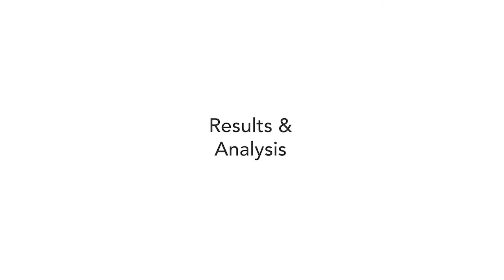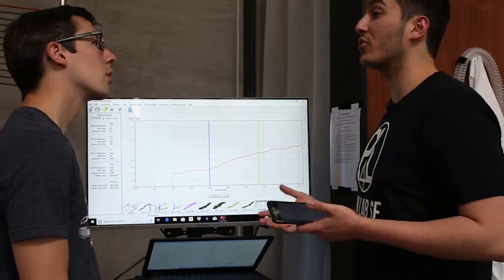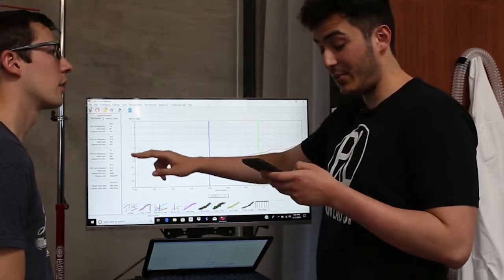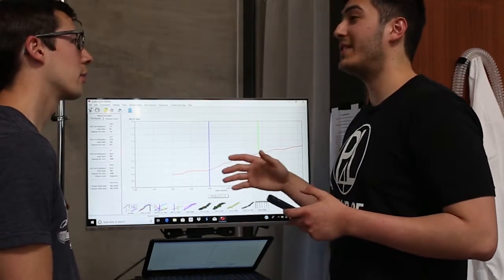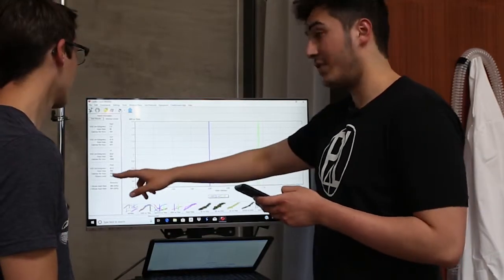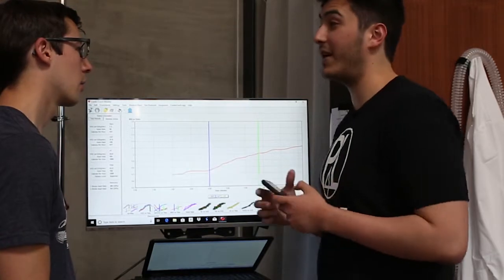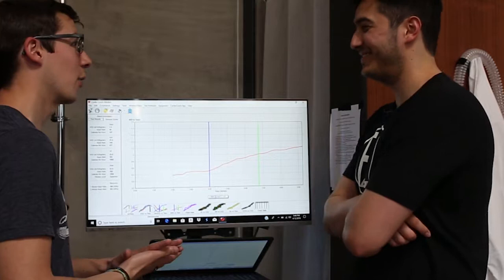So using a simple equation, I can actually convert your VO2 to actual running speed. Your anaerobic threshold, that max steady state, was found to be at 9.4 miles an hour, or 6:23. So that's theoretically what you can maintain for a whole 26.2 miles, a whole marathon, okay? And then your peak VO2 max was found to be at 10.9 miles per hour, and the pace is 5:30.